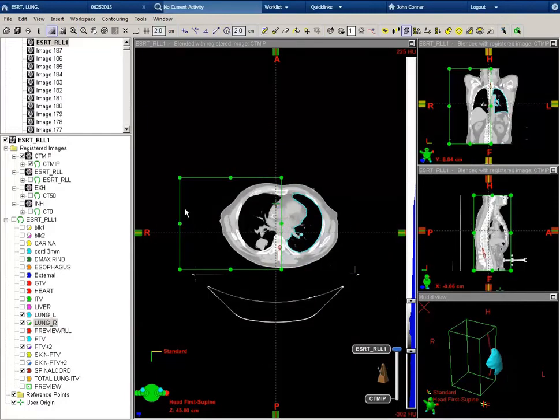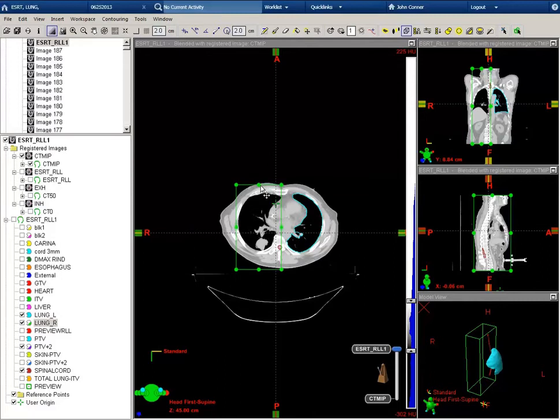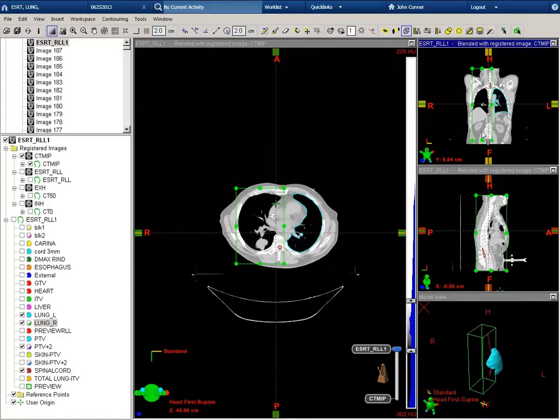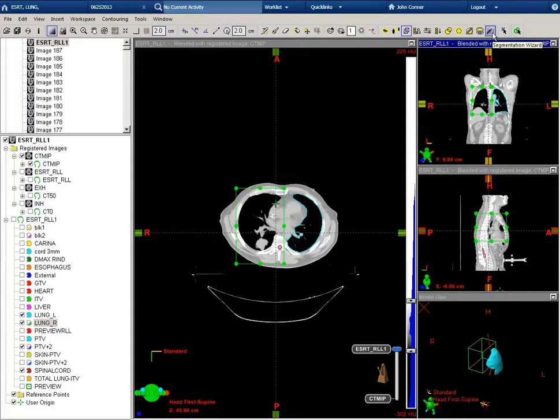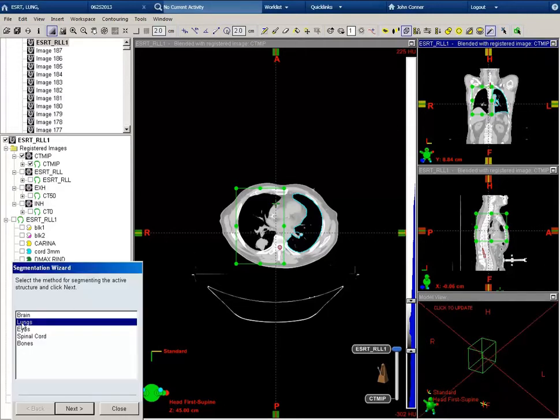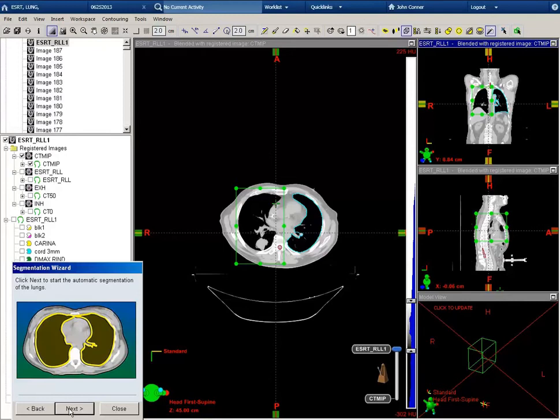I'm going to zoom out to pull in both the lateral aspects of the bounding box and the anterior and posterior aspect. And here on the coronal, I'll move the inferior and superior bounding box. And then I can go to segmentation wizard — I select that icon, select lung, and next.